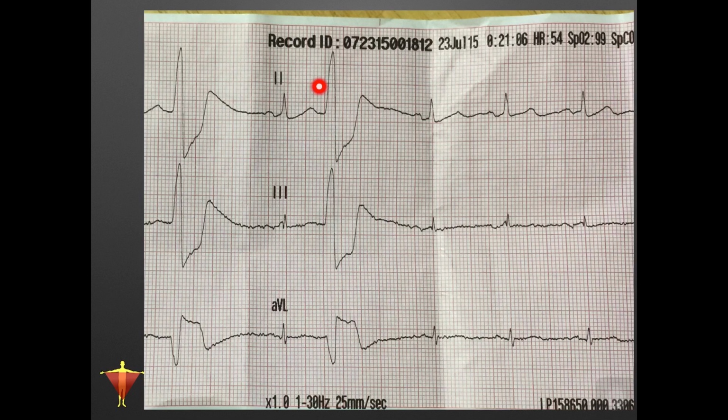Again, just something to point out. Sometimes they can be corrected. In general, they're not something we really bother with. They sometimes tend to rectify themselves.